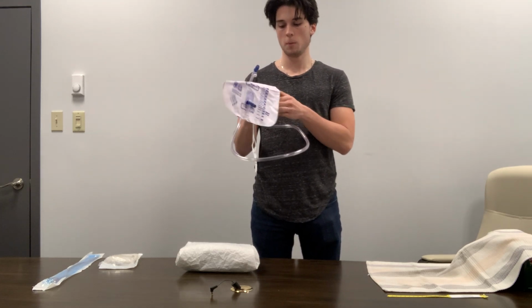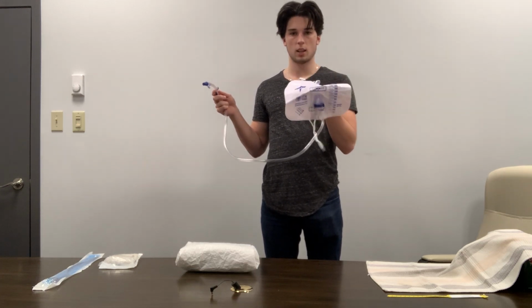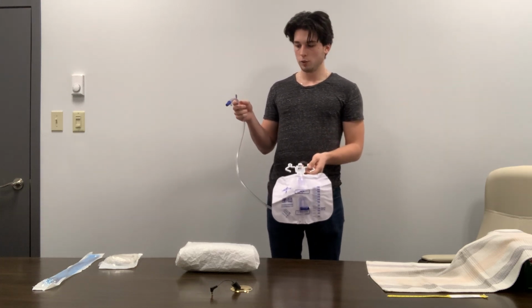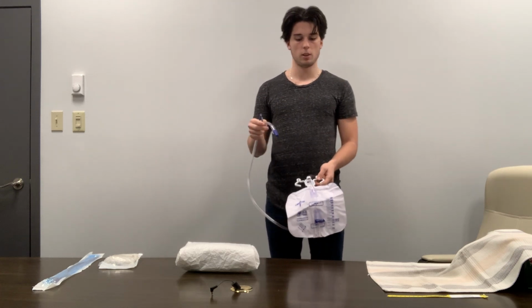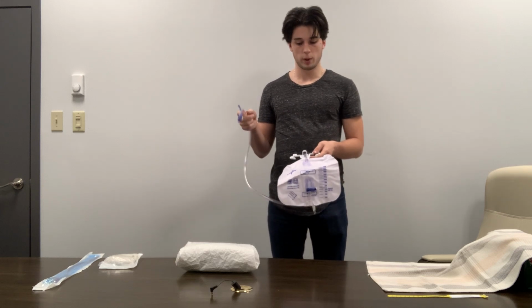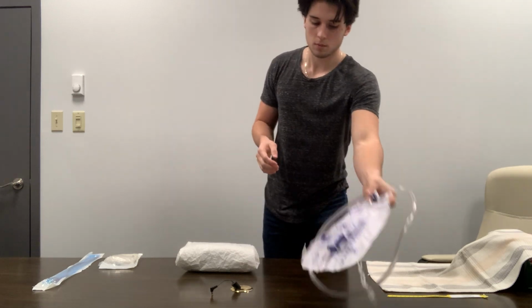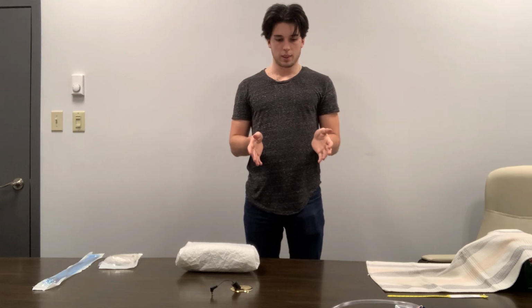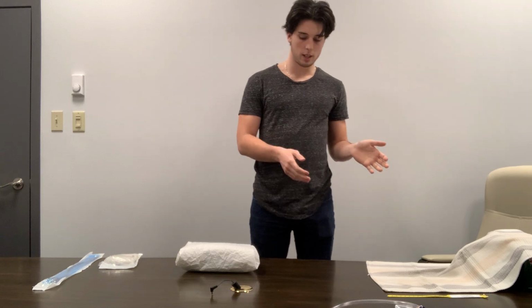So the first thing I'm going to do is I'm going to grab my drainage bag, and I'm going to connect this bag to a non-movable spot on the bed that's not going to be able to move, as well as I will attach this end somewhere near where I'm working, probably to a bed sheet somewhere right around me, just so I have easy access to it when I need it later in the procedure. However, right now we have nowhere to clip it to on this table, so for this demonstration, I'm just going to leave it up on the table here until we need it. So now that we have got that out of the way and we've explained the procedure and the patient is good to go with it, we can go ahead and expose them.